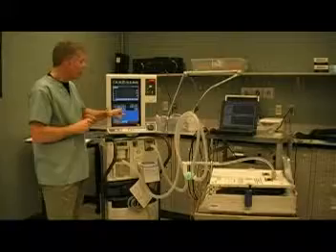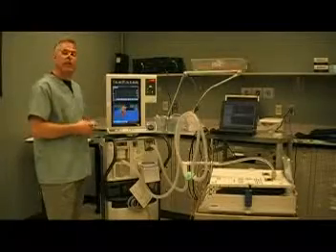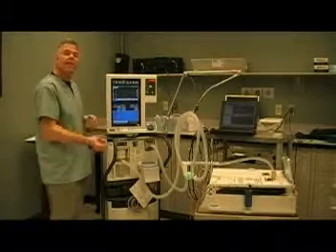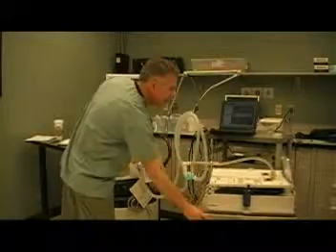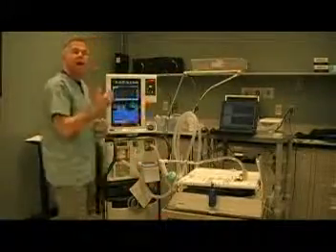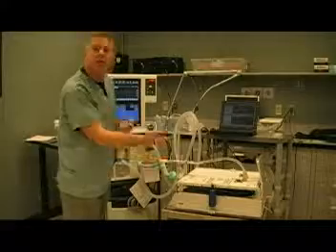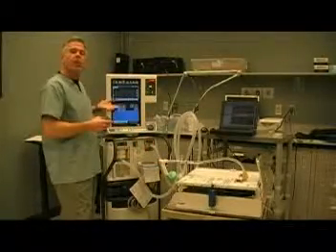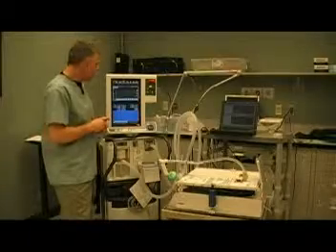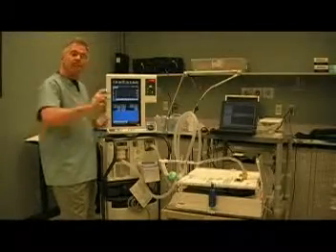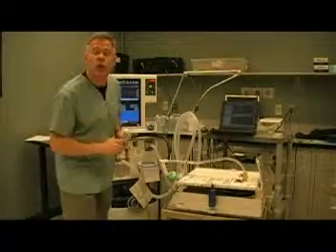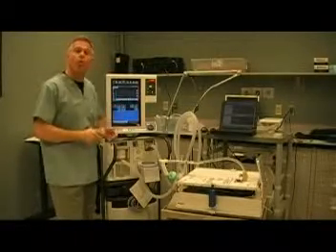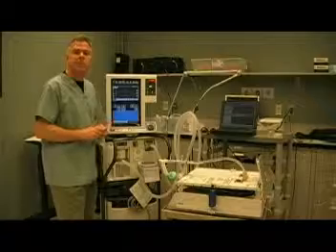Some of the other things I can set on the ventilator are the inspiratory trigger or the flow trigger. This particular ventilator responds to the patient's inspiratory flow demands, so if the patient does take a small breath, the ventilator will trigger an inspiration due to that change in flow. I can set the FiO2 — that's how I control the PAO2 of my patient's blood — and I can set the baseline pressure or the PEEP, the positive end-expiratory pressure.